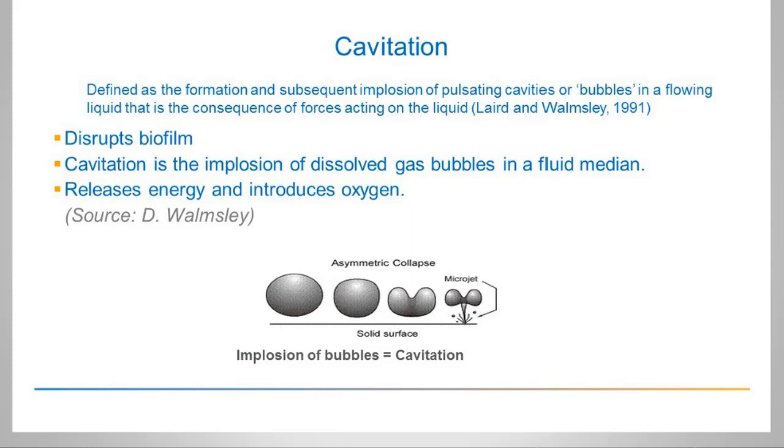Finally, cavitation. Cavitation happens simultaneously with acoustic microstreaming, and it has the potential to be bactericidal. The phenomenon of cavitation was first reported by Walmsley back in 1984, and it results when the water supply meets the vibrating tip and forms minute bubbles.